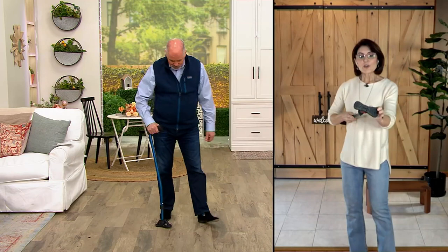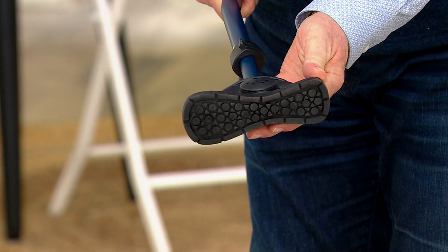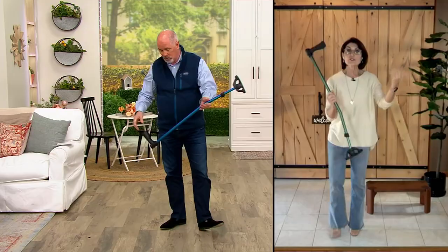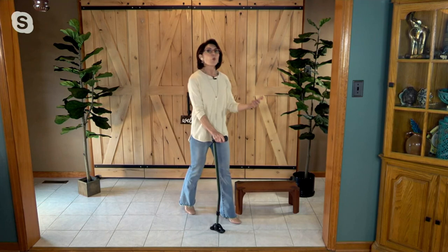Because of the foot — this articulating foot, the Swing Cane foot, is actually designed like the ball pad and heel pad of your foot. It is spring-loaded to articulate the way our ankle works when we walk. This gives you the largest surface area and fantastic traction. Through the entire walking process, your gait, you are getting the utmost in balance and stability. You're not keeping up with the cane — you are walking with the cane. It's an ingenious design.